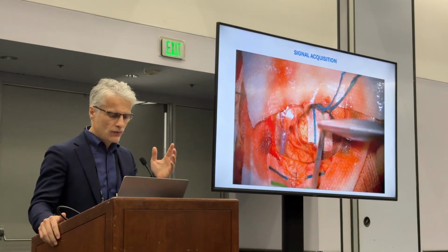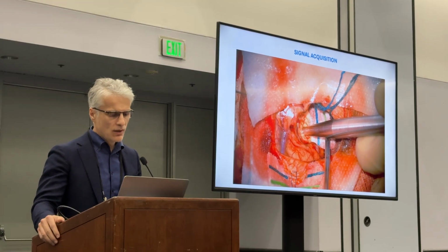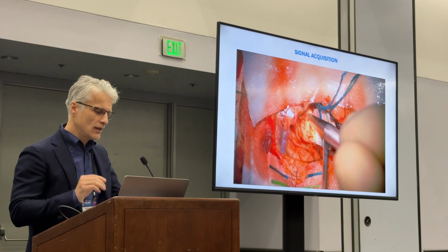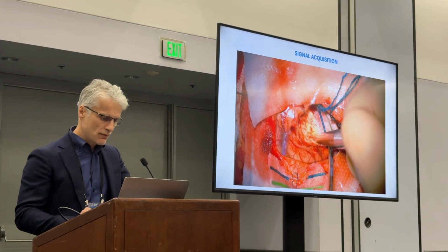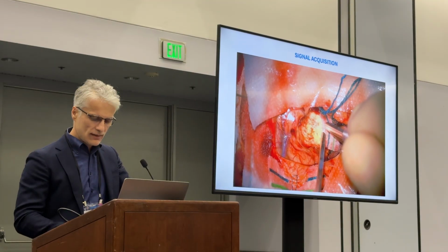This is a video of how you acquire a signal. So this is post-complete resection in my mind of a glioblastoma. Not sure though, probe the margin. And so this video is sped up, but just so you know, the time it takes to acquire a signal is less than 3 seconds. And you can just probe your entire resection cavity margin and you will have a readout that will tell you what the nature of the underlying tissue is.